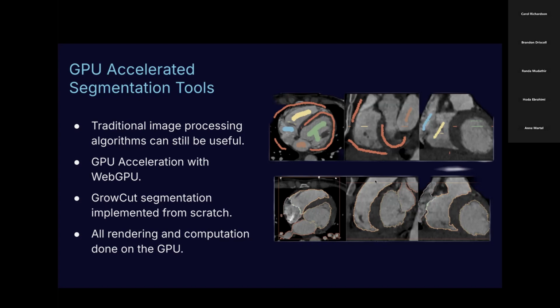So we are moving off WebGL rendering completely, and the new standard is WebGPU. And during the design of WebGPU, they have taken into account our medical imaging use cases that sometimes don't need rendering. We have computation that we want to offload to GPUs. So that's the great news about WebGPU, that we don't need to do many hacks to move a pipeline to GPU.